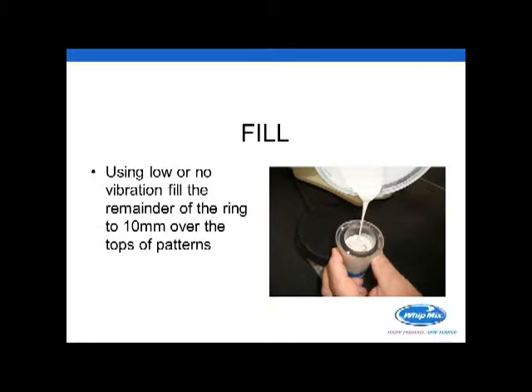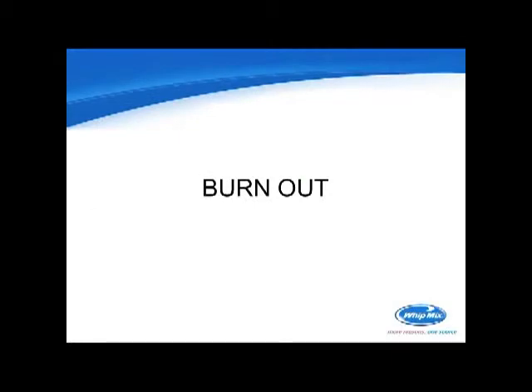Now I know that some of you prefer to invest the insides of your patterns first, but what that does is put a heavy ball on the top of a long stick. It's going to move even greater with the vibration that you have and could cause distortion or fracture. So this is why my preference is to do it this way. We still get the investment into the copings while the material is thin enough to do so, and they're supported by the rest of the investment that's around the base. And remember, you're going to fill to approximately 10 millimeters over the top of the patterns. Don't overfill them. This can cause blow-offs later.